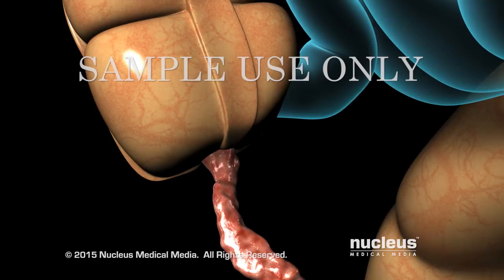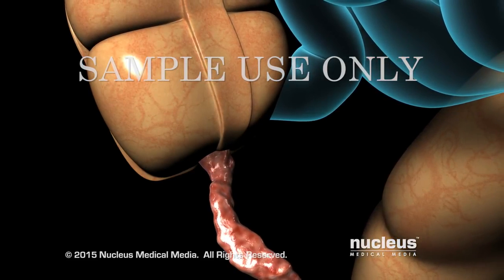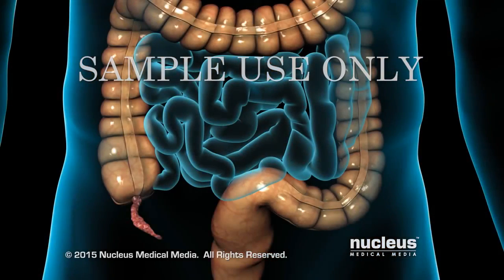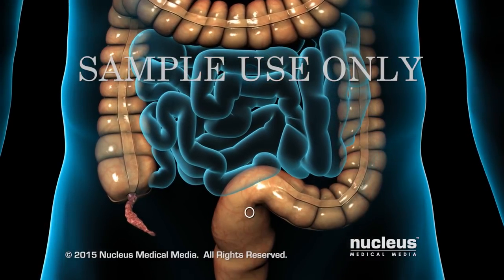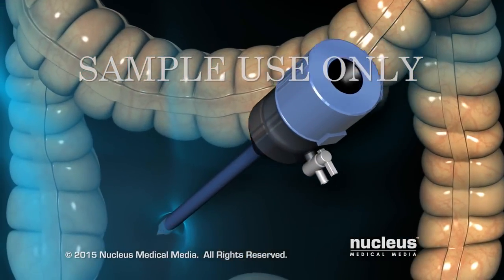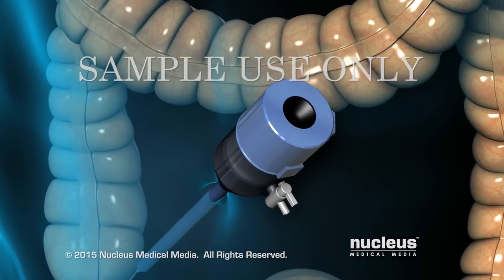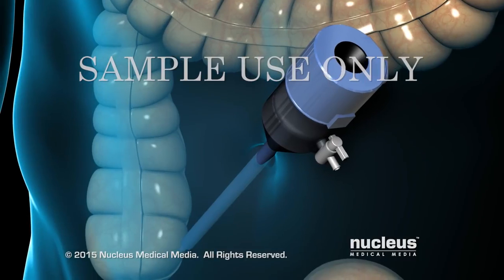The most common treatment for appendicitis is appendectomy, which is almost always performed on an emergency basis. Laparoscopic techniques require only tiny keyhole incisions or puncture wounds. To get inside your abdomen, your surgeon will make a small keyhole incision near your belly button, known as an umbilical port, with a tube called a trocar.